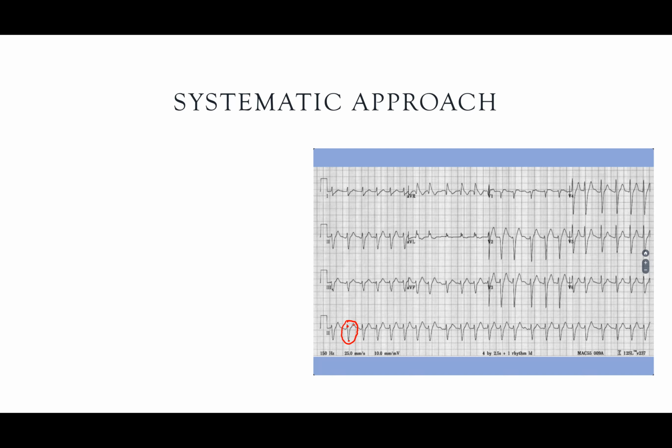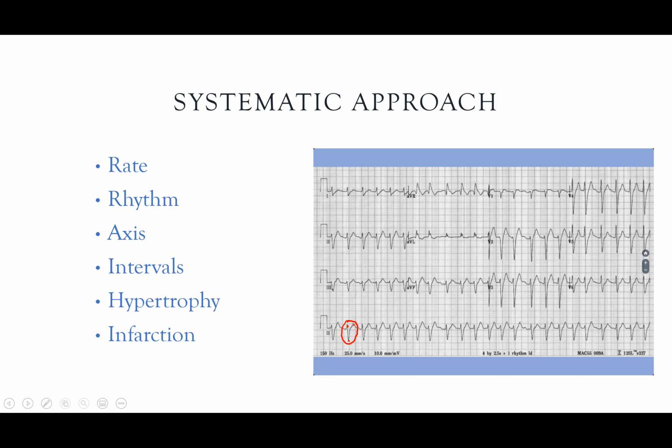The main thing is that you pick an approach, you pick a system, and you stick with it, and you use it every time. Now, this is true especially in your early days, as you're just starting to read ECGs, it's really important that you keep your system and you do your system every time. Otherwise, you're going to find that you're missing things. Okay, so what's the system?